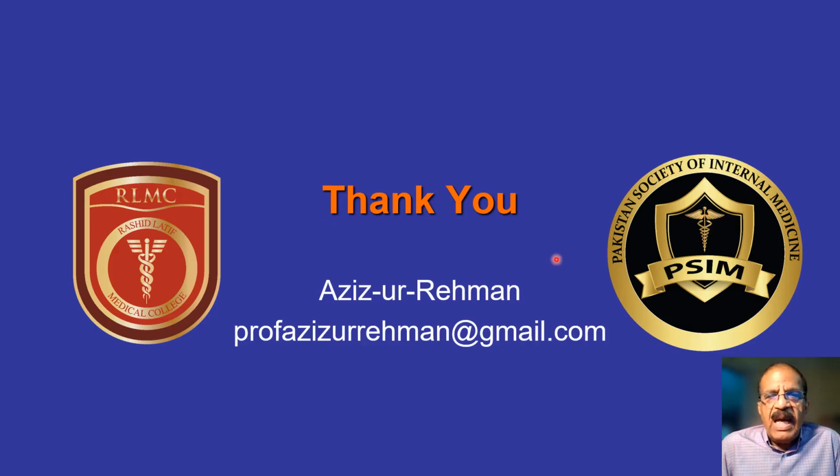So this was it. In today's module, I covered a patient with chest pain who had a normal ECG, and we discussed how to further proceed, and we discussed three modalities: exercise tolerance test, thallium stress test and coronary angiography. I hope this module was useful and you learned new things.